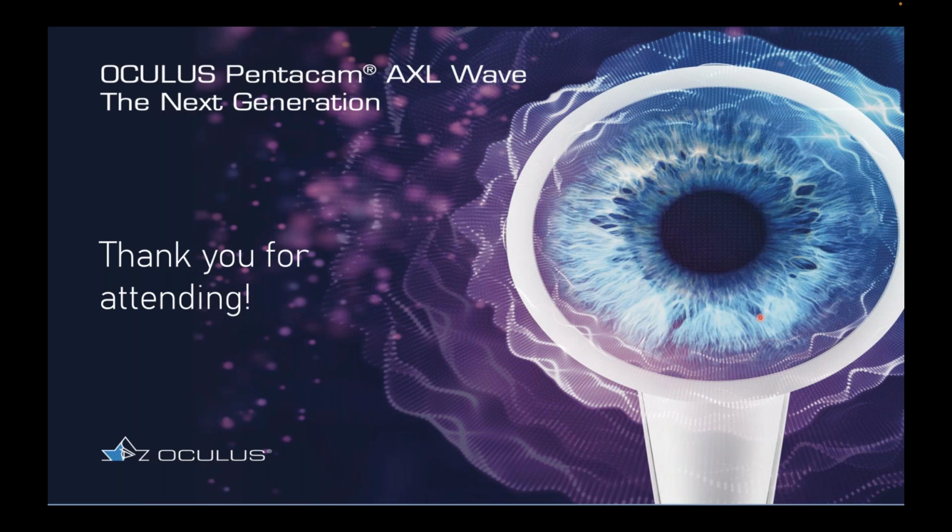Exactly. I want to create that red ring where I want it to be, not have it be, you know, well, I'm not very good at fitting, so this is the best we can get. And oh, by the way, my excuse is I get a better outcome. I can do better than that. I'd rather adjust the treatment zone myself and get it to be smaller if I want more red in the visual axis. So again, I think we can do better. I think our standard for what is a good outcome has changed.